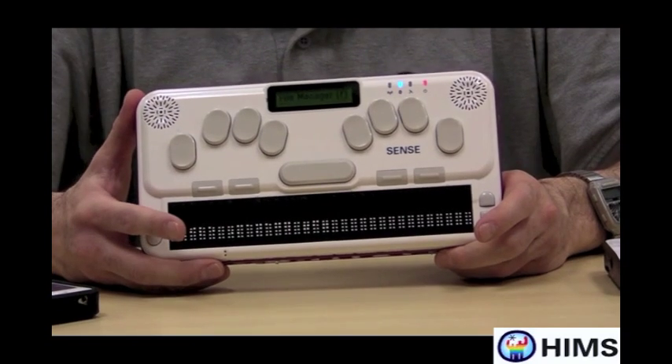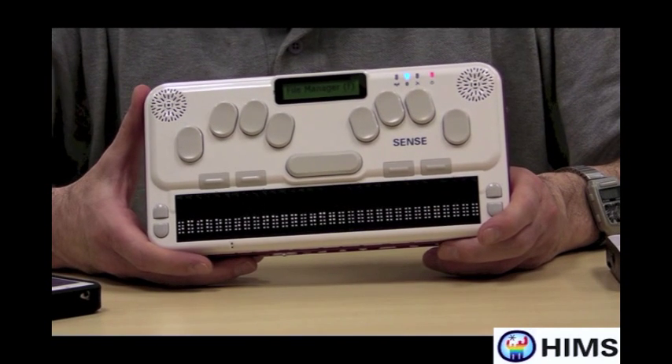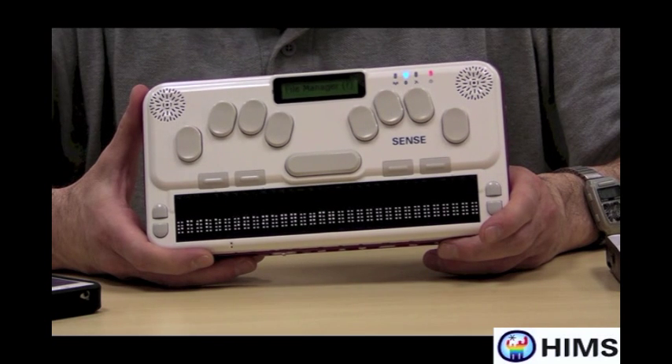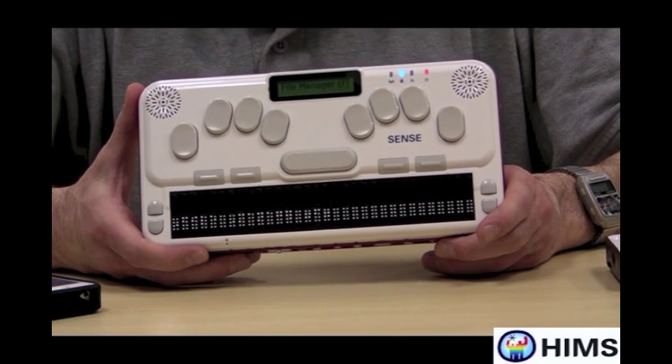Today we're going to be talking about our new BrailleSense U2. It's a brand new note taker. It's a very fast note taker. It has a lot of storage internally, up to 32 gigs of storage. Its processing speed is very, very fast.